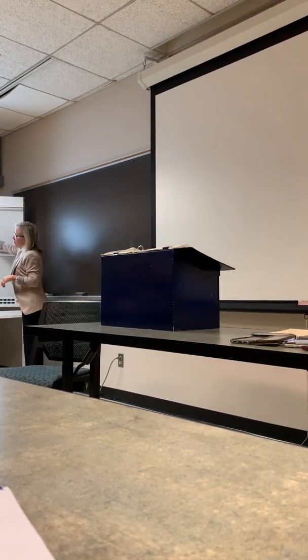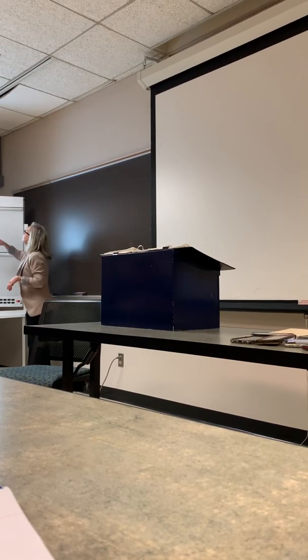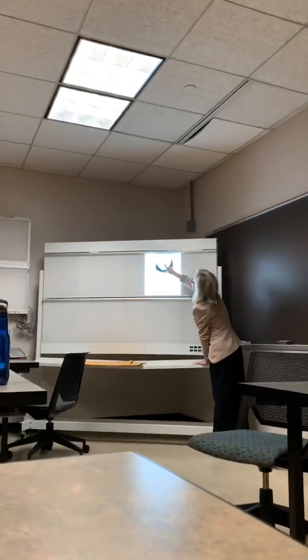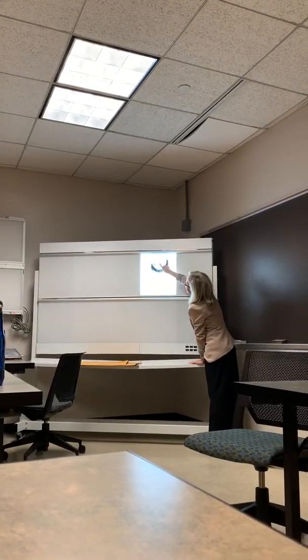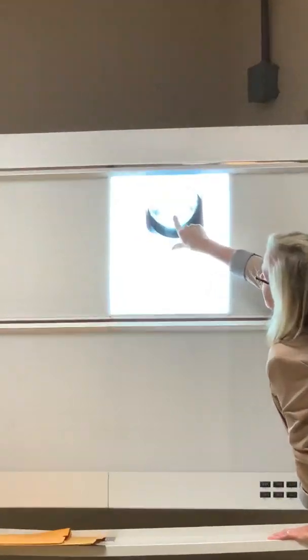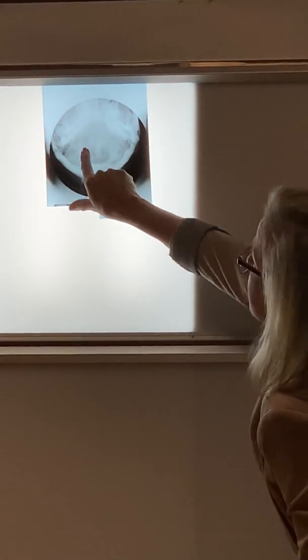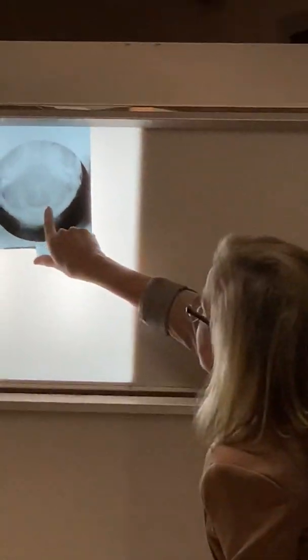All right, so here's the Fuchs. You can see that the chin, by the mandible, the chin is way up like this. You can see this is the foramen magnum here, and the odontoid process is right there. So the foramen magnum is circling around the odontoid process. You can see even the lateral masses of C1.